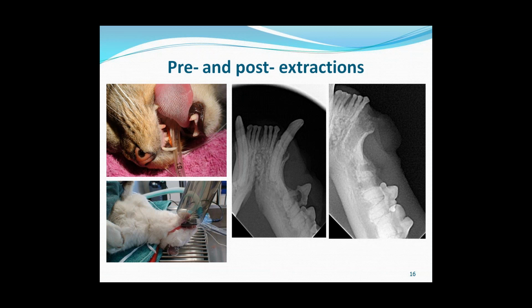The tube head is angled at about 20 degrees from the vertical, and that gives you a good position for the lower canines and the lower incisors. You'd want to angle it slightly laterally if you want to get the premolars in as well.